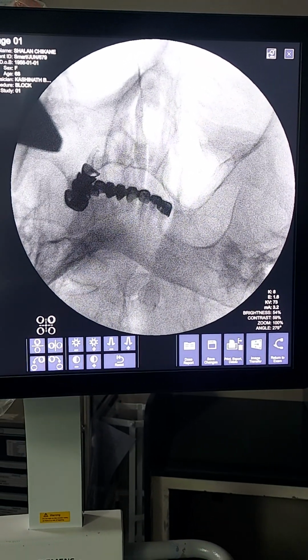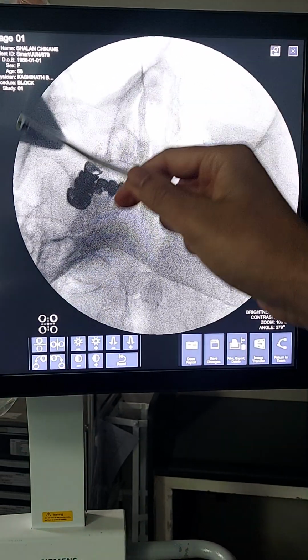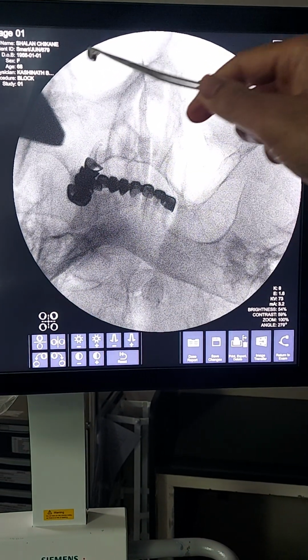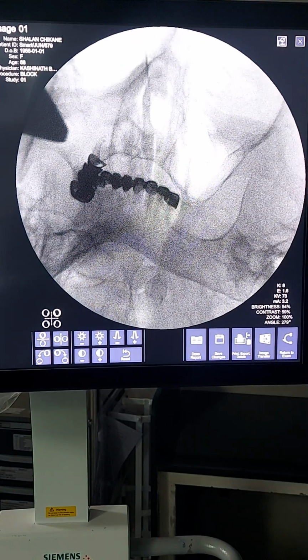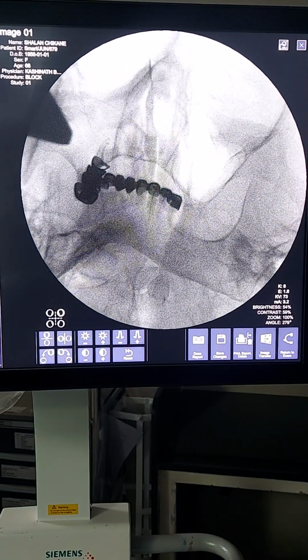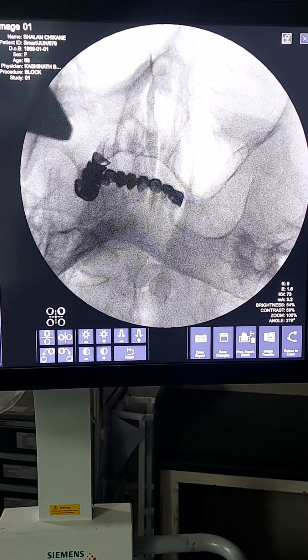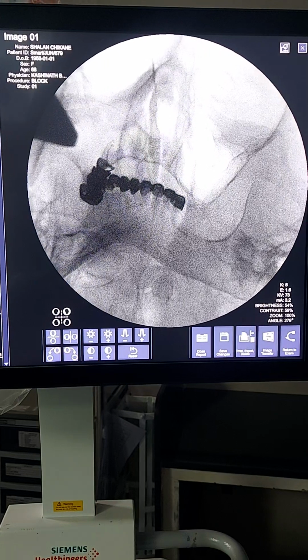After that, you are supposed to go for the ipsilateral tilt. In this image, even when we take a neck extended patient, in the first shot we can see everything, but after the submental view is obtained, you go for the ipsilateral oblique. Once you go for ipsilateral oblique, identify various structures. Do not focus on foramen ovale at this point.